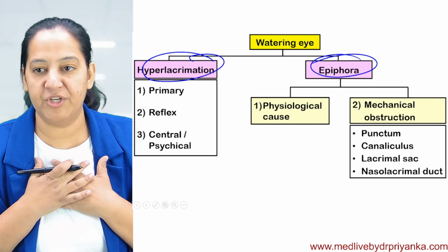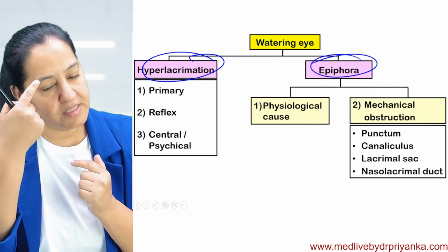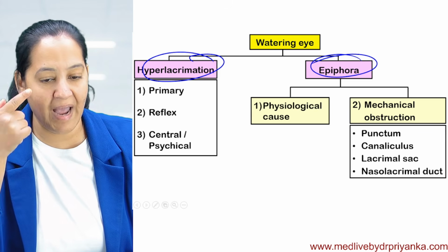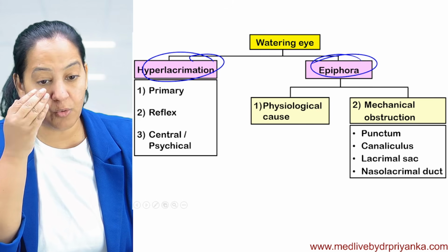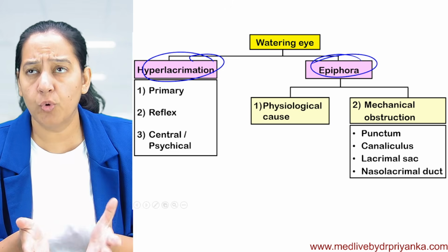So suppose I'm a patient, I'm coming to you, you are an ophthalmologist, doctor, I'm having watering eye, this eye, I'm having tears. You say, ma'am, don't worry, there can be 2 problems. Either there can be one of the 2 problems. Either your gland is defective, it is producing more tear, or your drainage is obstructed. That gland is normal, but the drainage is obstructed. So whatever tears are formed, they are not drained properly. So let's perform Jones primary test.